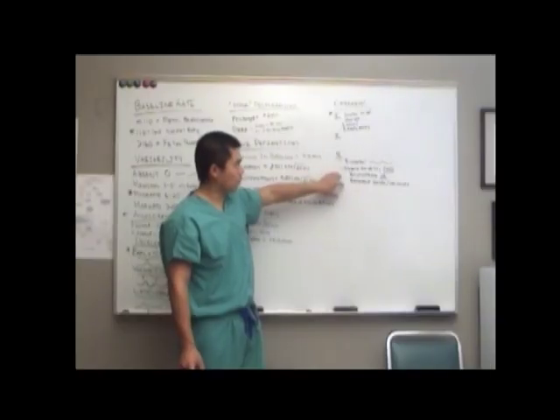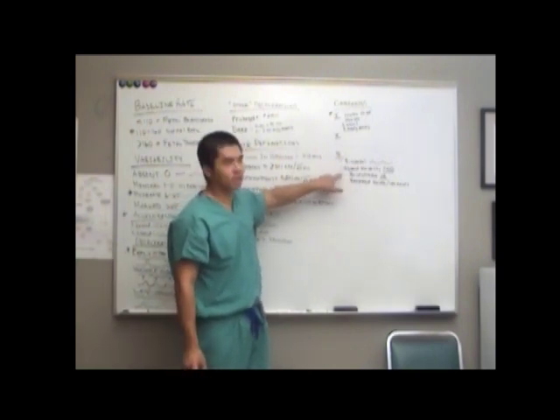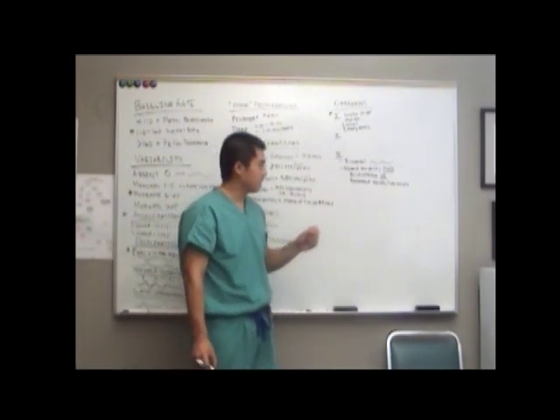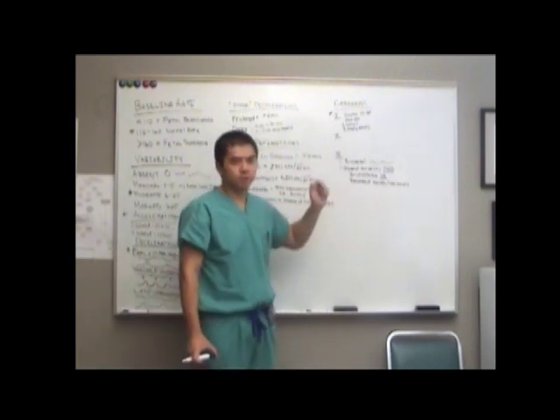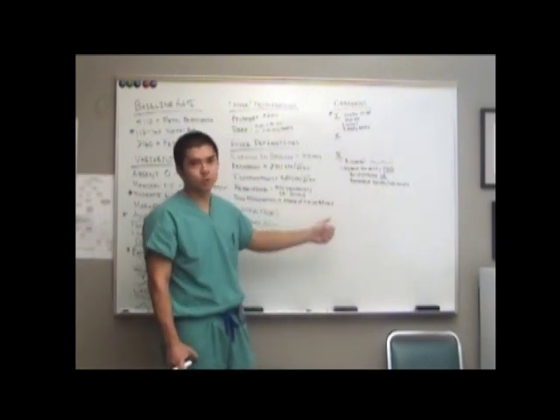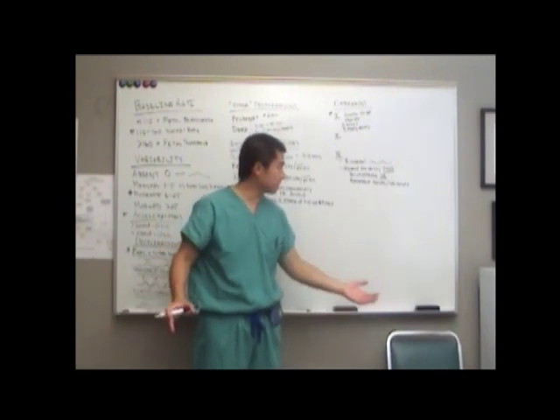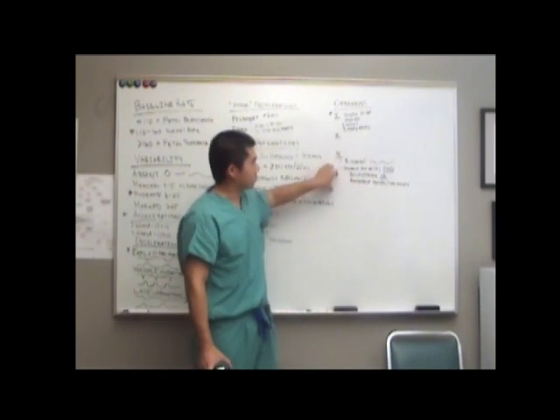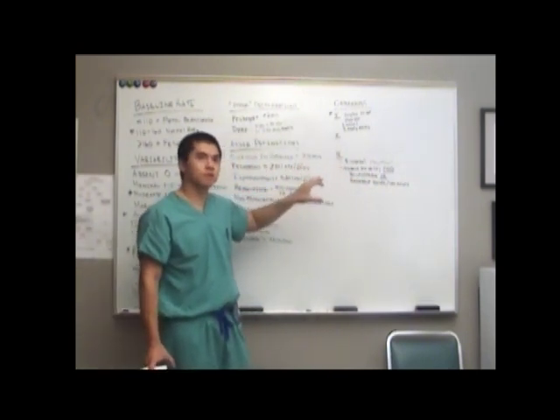And I kind of bunched this into one, but I kind of think of all this as the same because it kind of forces you to remember that you have to have absent variability. Because sometimes you'll have some really ugly fetal heart tracings that are not category 3. So you could have minimal variability with a heart rate in the 60s, but that's still not category 3. Not by the definition that they set out. Now, would most people sit on a category 2 like that? Probably not. But this is what a category 3 is. It's only these two things. So it's a very strict definition.